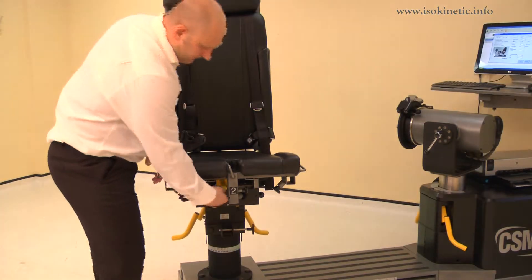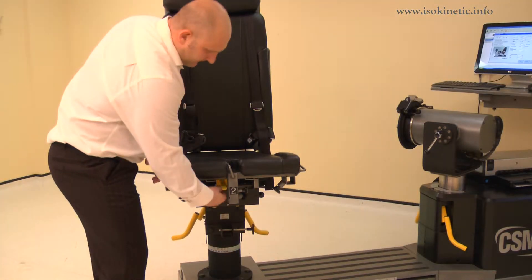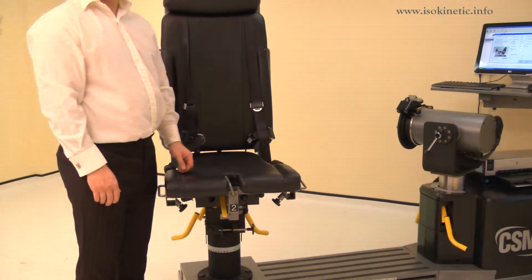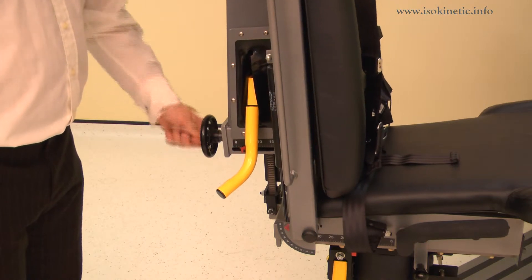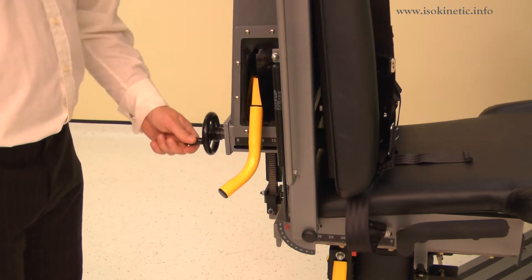Set the seat to the down position by lifting the seat and releasing the lock. Set the chair back translation by winding the handle. Adjust the chair back translation to position 15.